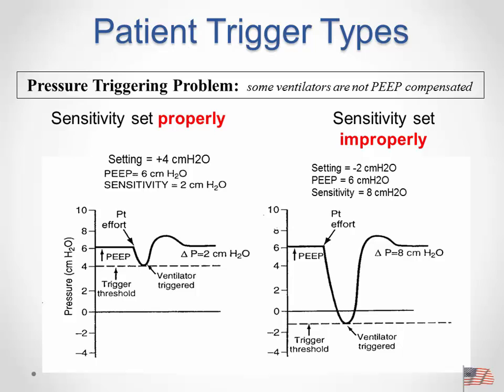So you have to adjust your sensitivity appropriately. If I have 6 of PEEP present and I want to have -2, they would need to draw back -8. So I really should change my setting to something higher. Does that make sense? Yeah. How do you draw that out? Pardon me? I can look at it, but no, it doesn't make sense looking at it.